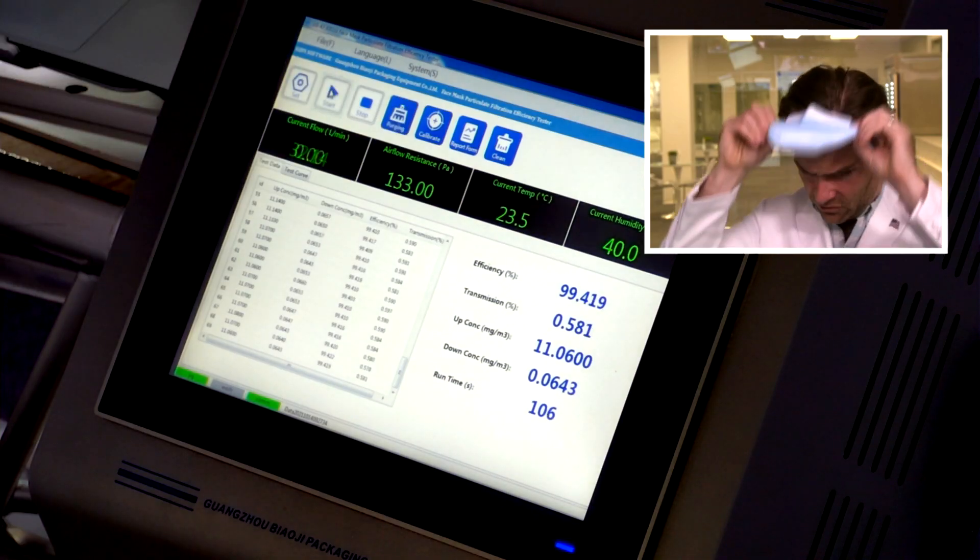Okay, pretty good fit. Pretty good breathability. I am getting a fairly medium to strong plastic — actually, a cardboard smell. It basically smells like a cardboard box, but it's not anything horrible. Pretty good seal there. I'm going to switch over to the PFE machine.